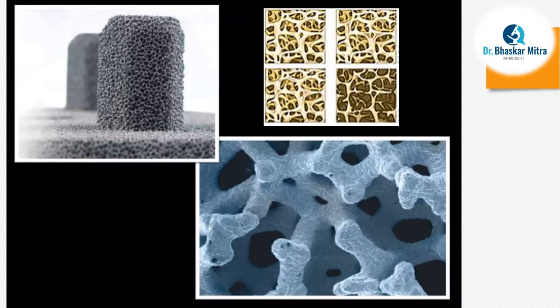Starting with this, what we see is a structure made of different columns, a pattern of network. In a building there are some beams or columns that make a typical structure. Actually this is a framework or meshwork that holds the whole structure.